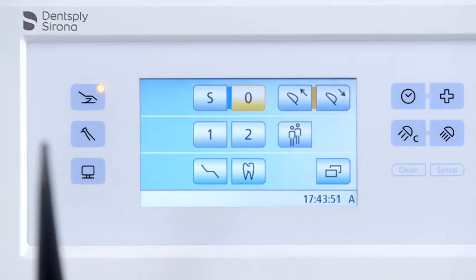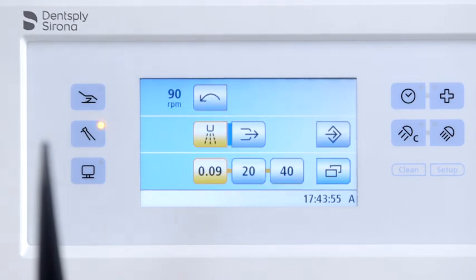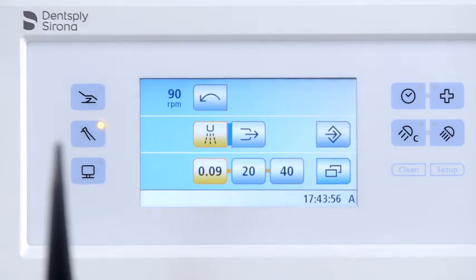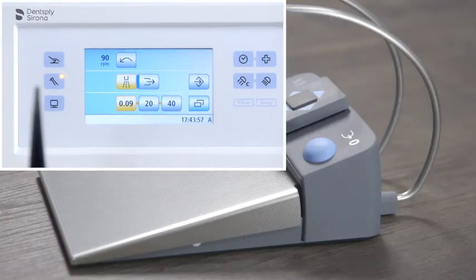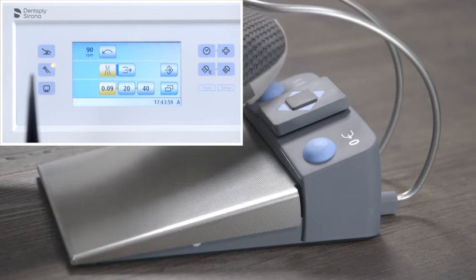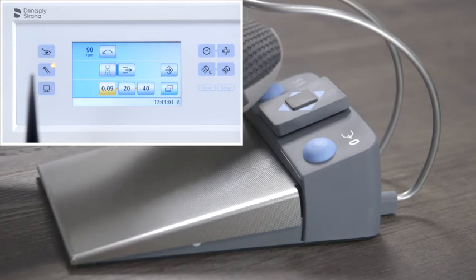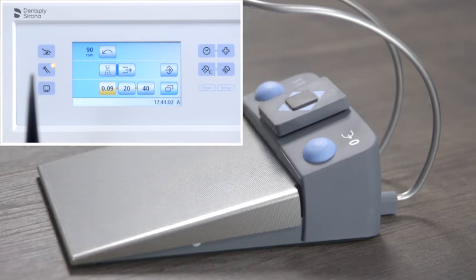When an instrument, for instance motor, turbine or cirrosonic TL, is taken from the holder and the left button is pressed, spray, air or saline respectively is switched on or off.